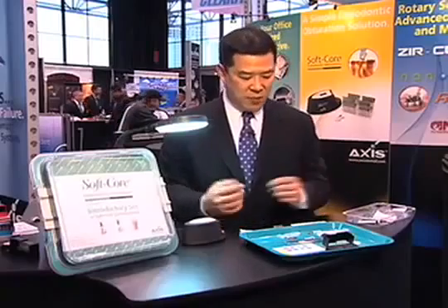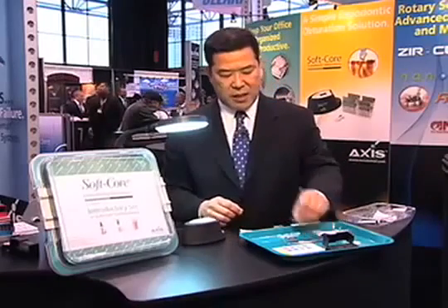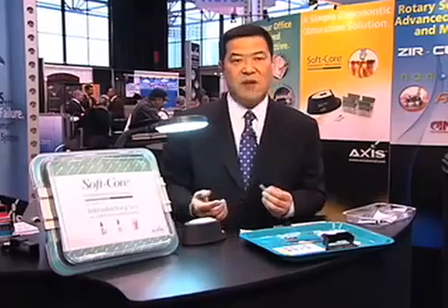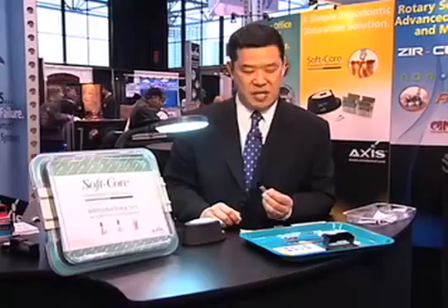Let's talk about what we would do to obturate a single canal. For example, let's pretend that you have finished and cleaned and shaped the canal. It's looking nice and clean with whatever system you do. One of the things I find that is really important is the cleaning and shaping. It is absolutely imperative that you do a great job of cleaning and shaping the canal. Obturating a canal with Soft-Core is not a replacement for a good cleaning, shaping, irrigation, and sterilization of the canal.